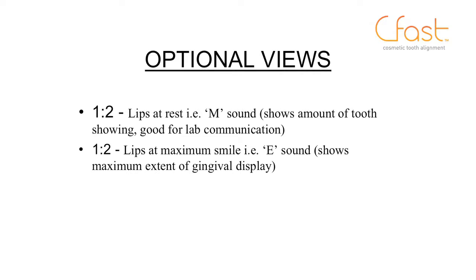There are a couple of optional views that we mentioned, and that is, first of all, the M sound. This is where you ask the patient to say mother and just stay with the lips slightly apart. And that's going to assess our incisor display at rest, which is an essential part of smile design and for any restorative cases. And the other picture we take is the E sound.